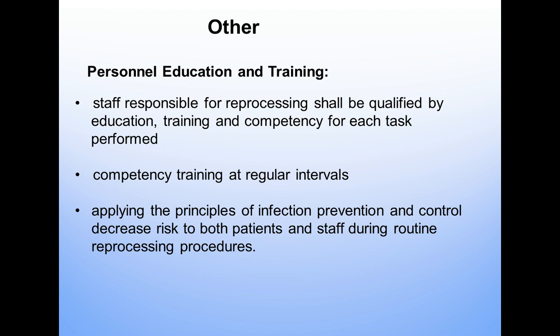Personnel education and training. Again, I can't emphasize enough the ongoing education. Training the trainer is not the proper way for educating somebody today. You must require education and training from the manufacturer. And there should be some people who are trained in the department who can provide the training to other employees as required.